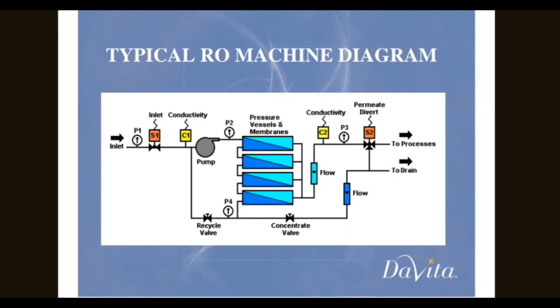So in that diagram we can see the water from the pre-treatment system passes to a pump, which flows the water to our membranes, and here the purified water passes to our storage tank. From that area, the water which is rejected, we are going to throw it.